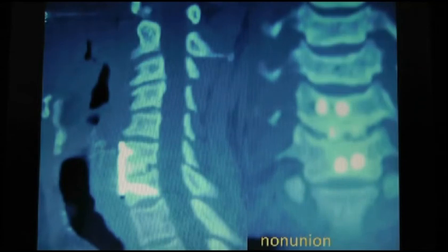So, okay, so Adam, what do you see here? This is a CT scan, sagittal and coronal reformatted images. And you have an anterior fixation plate at the, let's see, 2, 3, 4, 5, 6, 7. So there's a plate and screws. There's some metal, actually, I don't know if it, it must be metal. It's so dense at the disc space.